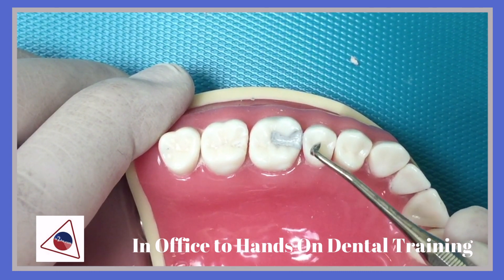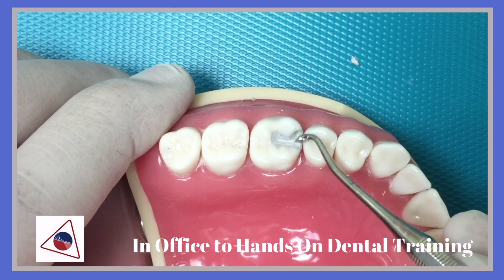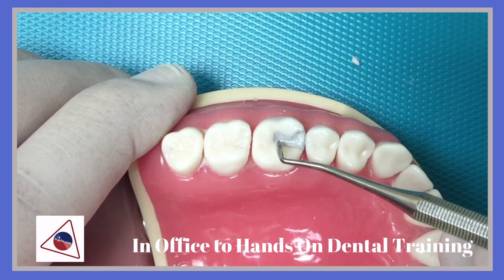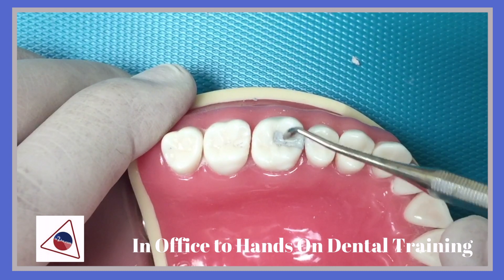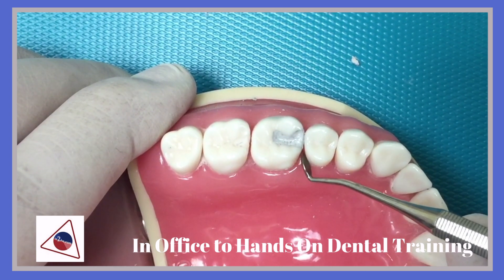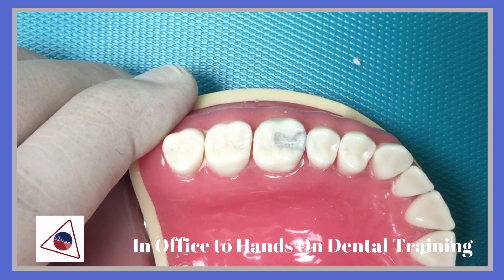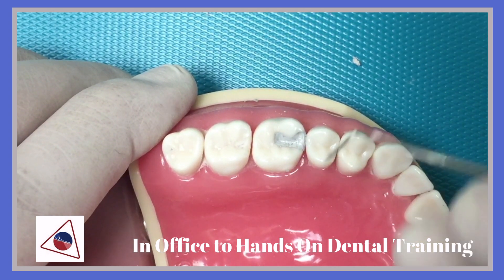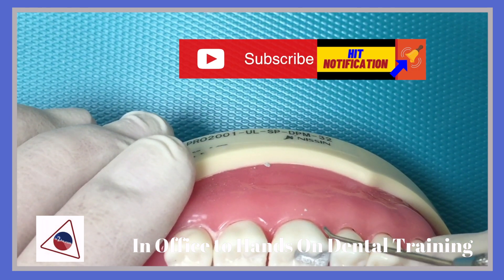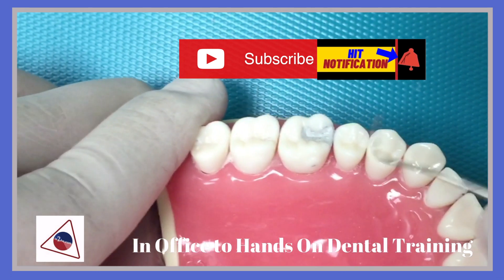Now, once the matrix band is removed, we can work on the marginal ridge equal in height to the adjacent tooth, being able to carve that, and continue to create the occlusal anatomy using the tooth structure and adjacent teeth. Removing the excess flash and excess amalgam from the gingival margin using the explorer, on the buccal surface and also on the lingual surface.